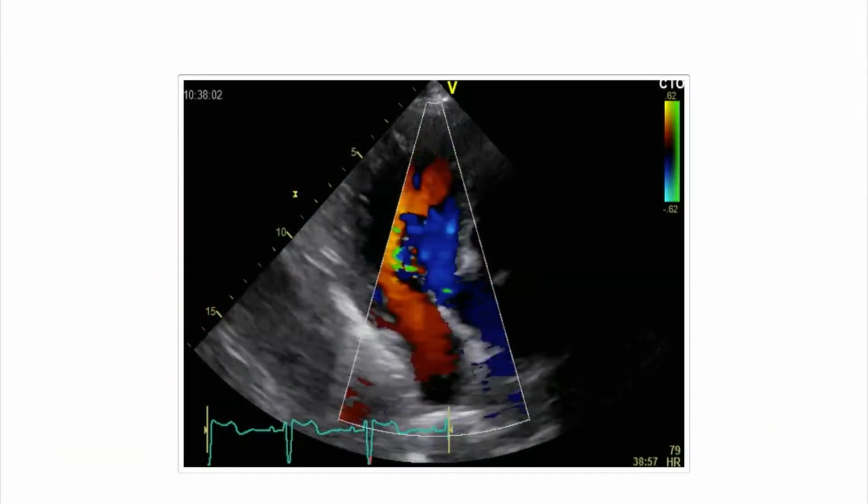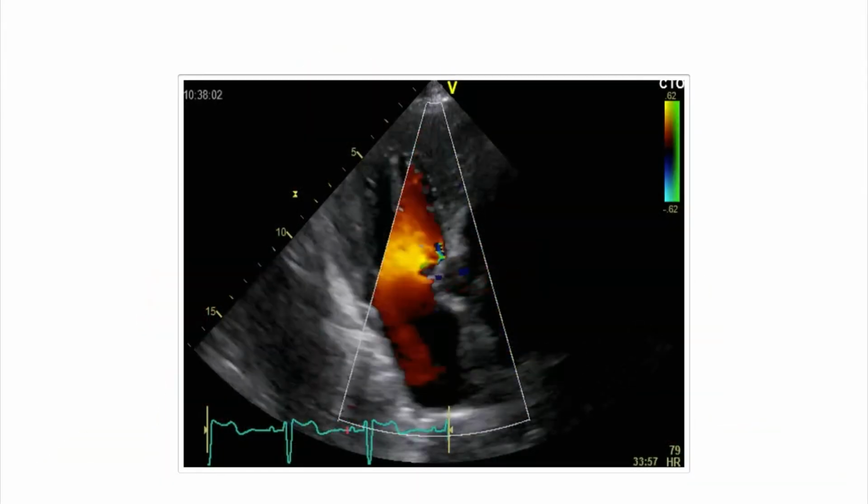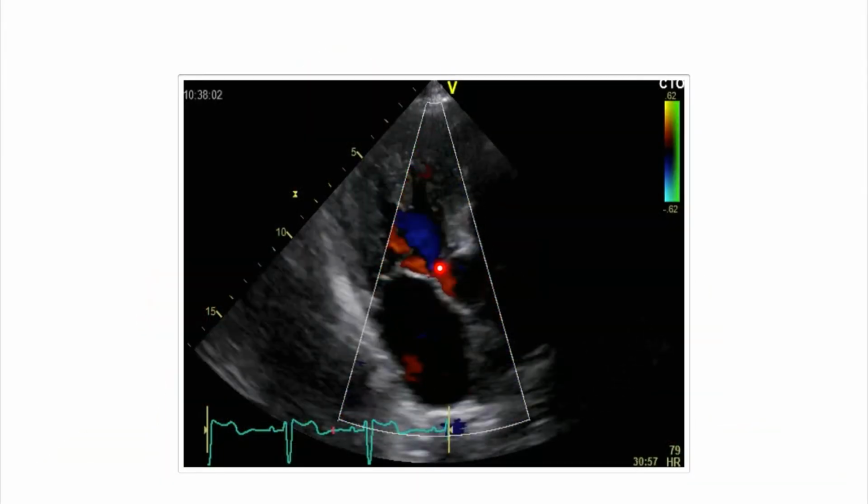For you at this point, all you need to know is that probably the most important factor in quantifying aortic regurgitation is still the color Doppler, looking at it from a transthoracic approach, and your imaging qualities. Why? Because take a look at this example here. Does this patient have aortic regurgitation? Well, maybe a little bit.